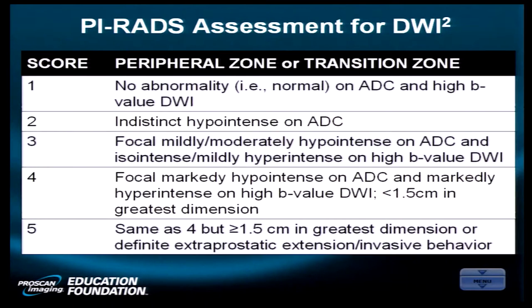Diffusion weighted MRI. That's what you came to hear about. DWI MR, here's how it works. Let's take the example of a stroke. When you have a stroke, the water that is normally micro-diffusing in your brain along white matter tracts goes into the damaged cell membrane of a neuron, and it gets trapped there. It can't move around. And that's why you get diffusion restriction in a stroke.